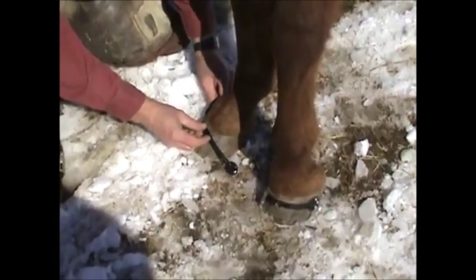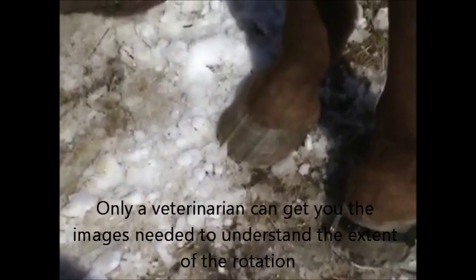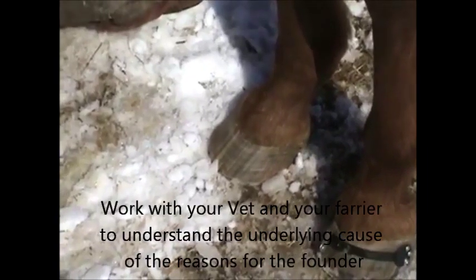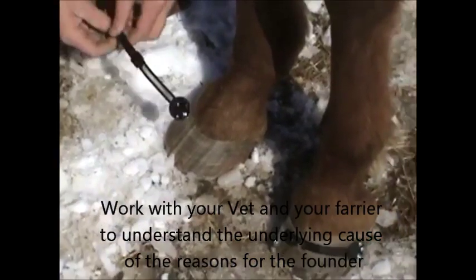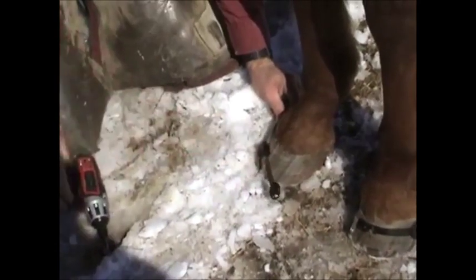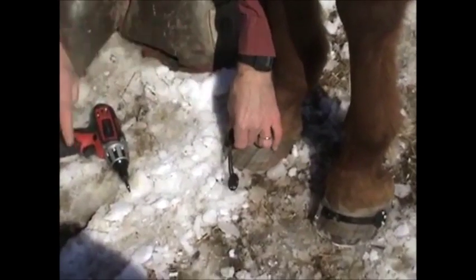From width and placement — you can see this foot has a different angle on it, so it's even going to stick up a little bit more than the other one. When I'm tightening this one up, you can actually feel the hoof wall move. Especially this time of year the feet are a little softer with the melting snow — the frogs are nice and soft and the hoof walls are a little softer.